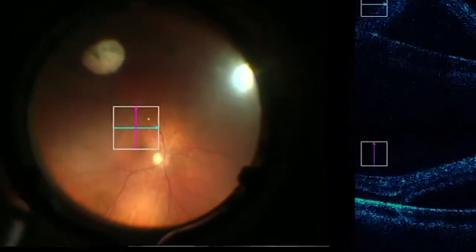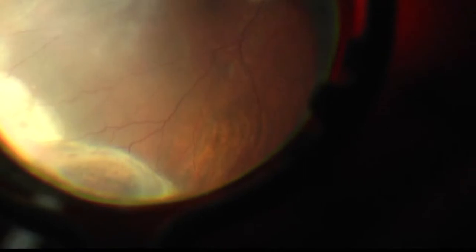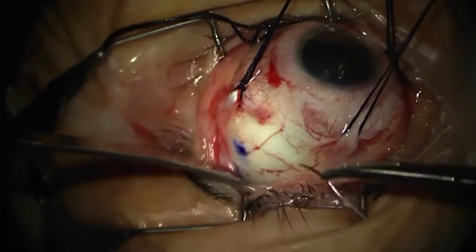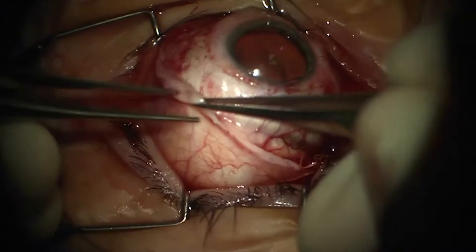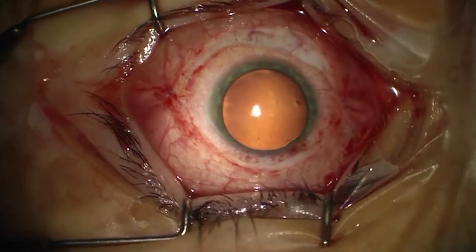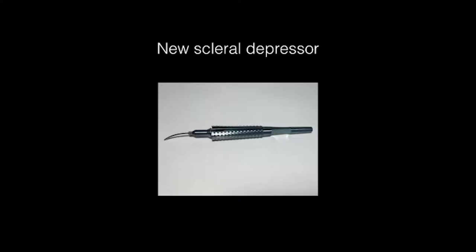Then we apply cryo, and we can control and see the cryo applications. And this is again one of the cryo applications. And then we can suture the band or the scleral buckle, very minimal, only in the certain place where we need to suture it. And the surgery is done. And sure, you have to close the small sclerotomy from the chandelier. We like this surgery, and if you try this technique for scleral buckling, you will like it too, because it's more convenient to do.